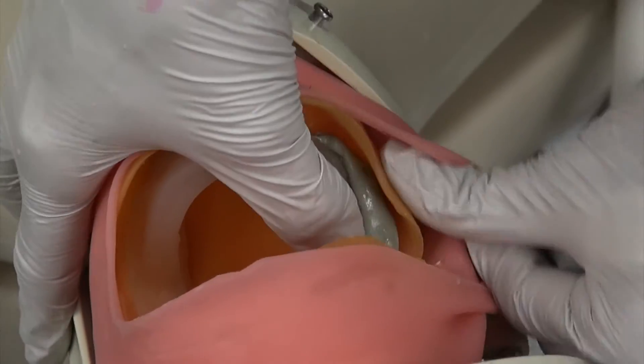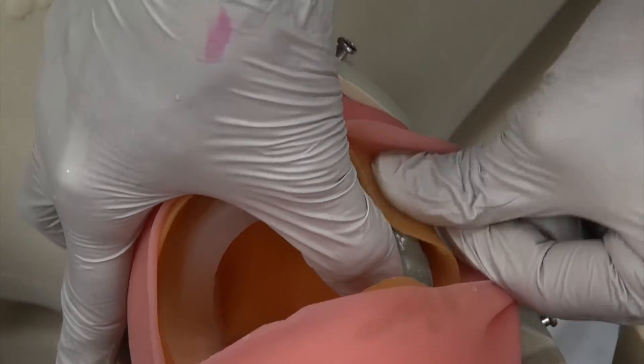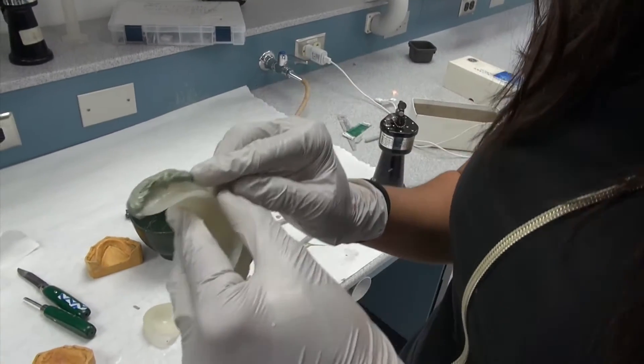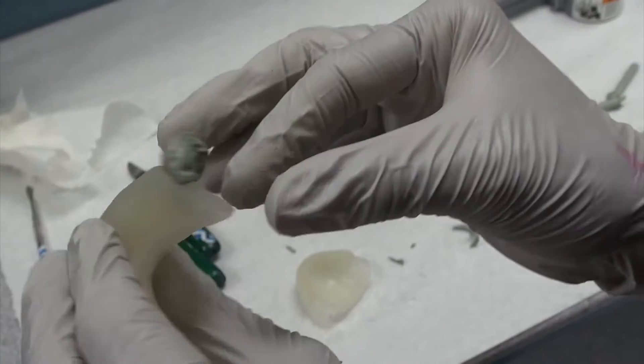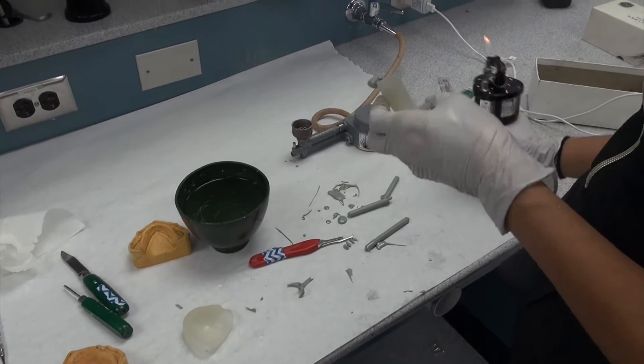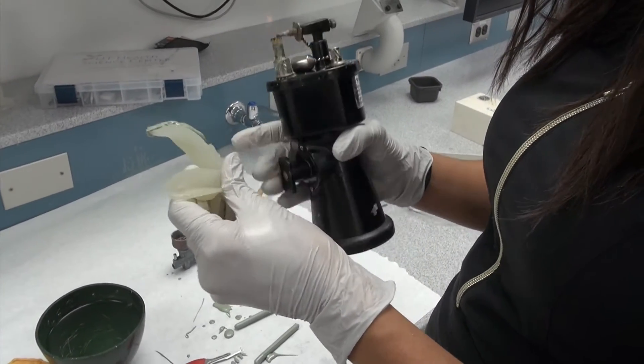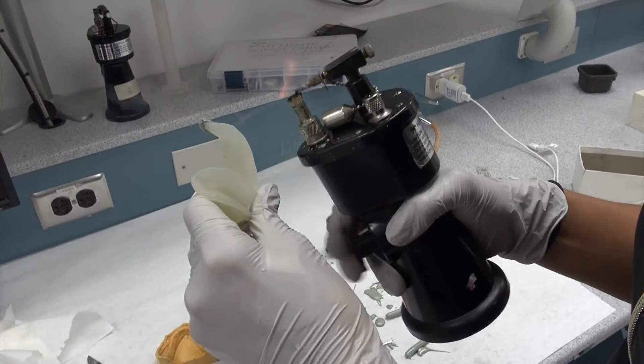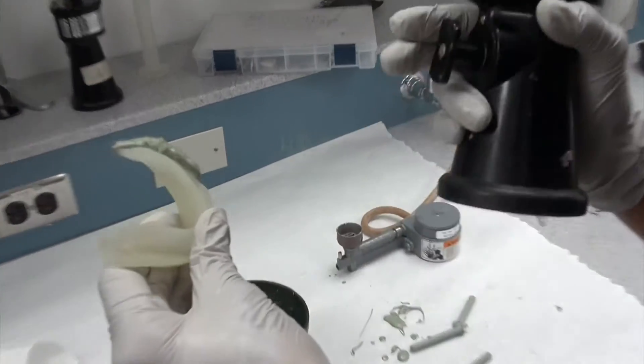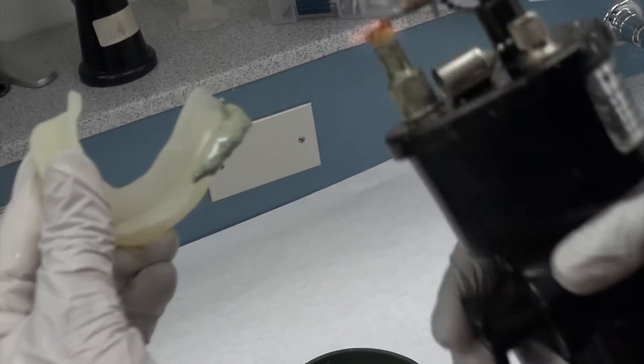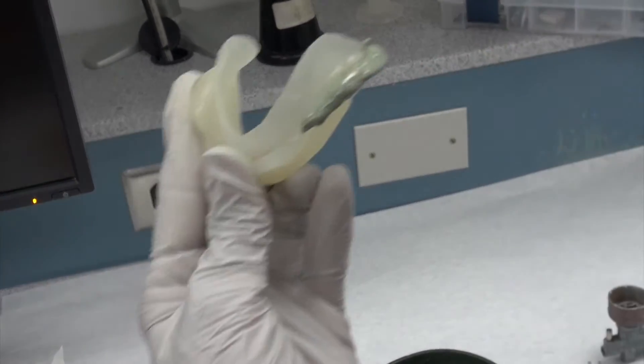Let's see how I'm pushing against it. Anything that's on the lingual surface really will prevent it from seeding properly. You can see how it's kind of clumpy, the voids here. So we would go back and reheat it. See how it's smoothing.